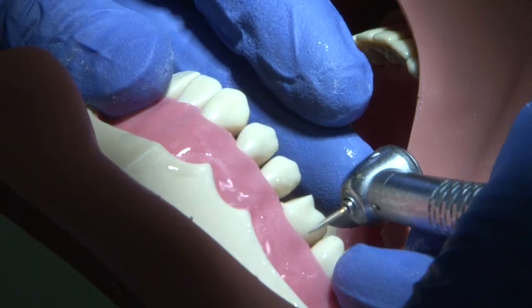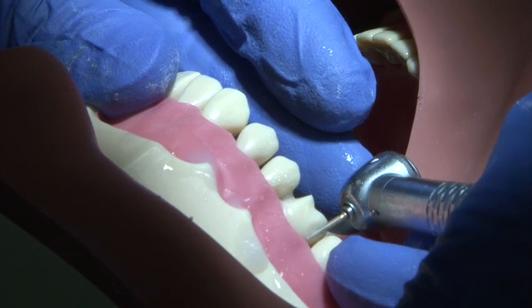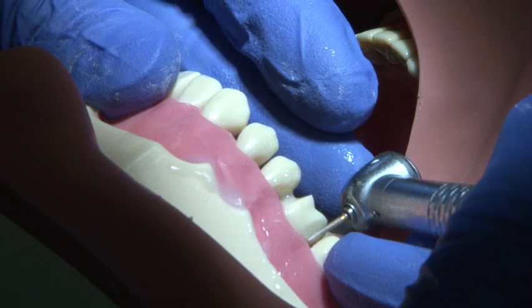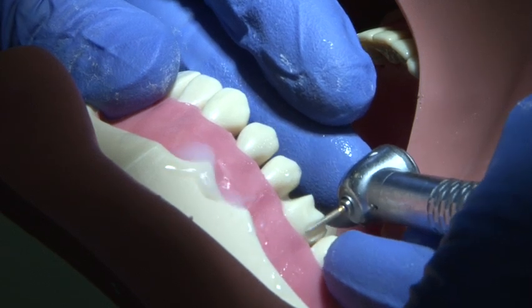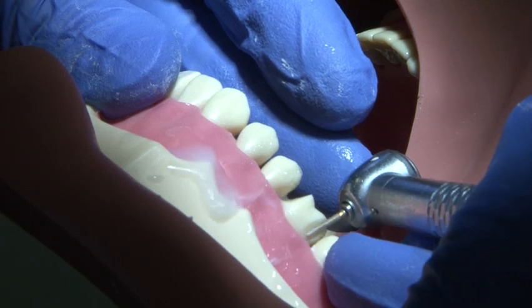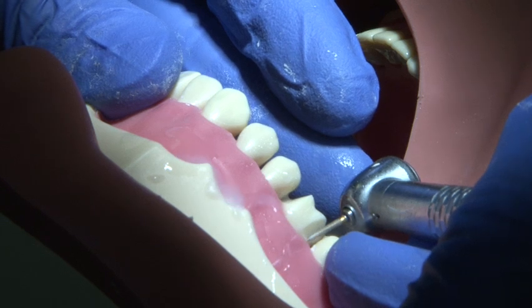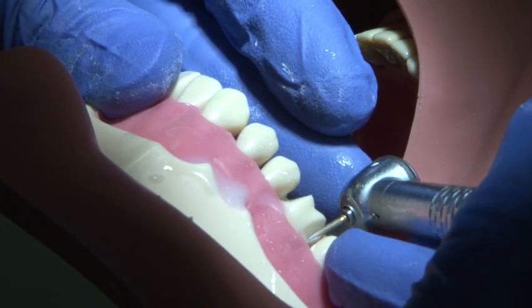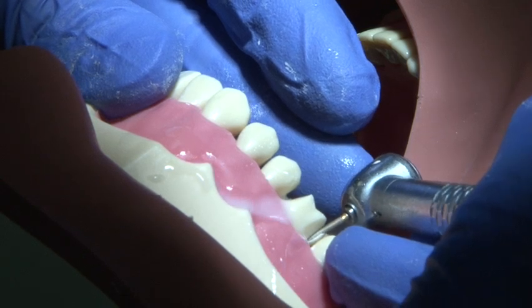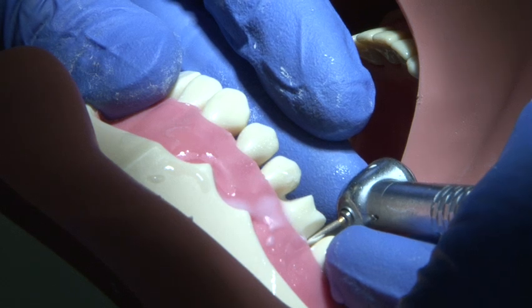Once you have cleared the interproximal contact, the process is repeated for the distal surface. Use a smooth continuous action supporting your burr hand at all times to gradually break through the interproximal surface.